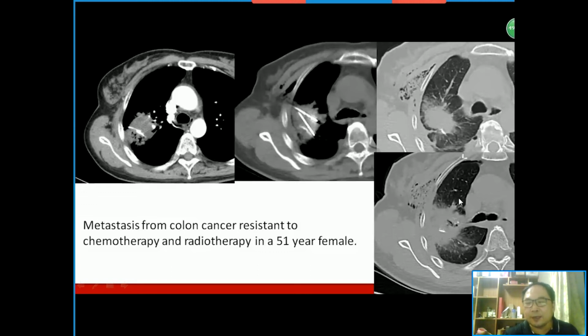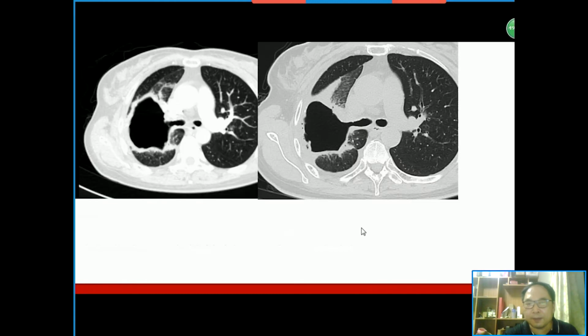This is a CT scan after ablation, but she developed severe cough and mild fever. And 1 month later, on the CT scan we can find 1 cavity, and severe cough and still mild fever. So we gave her medicine to relieve cough, and the lesion became smaller. We also did a follow-up. We can see the lesion communicates with the cavity, communicates with the right bronchus.